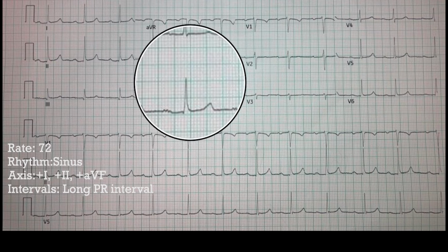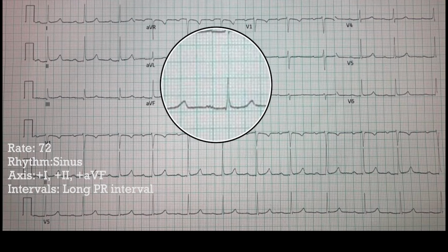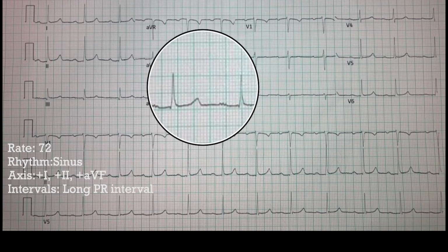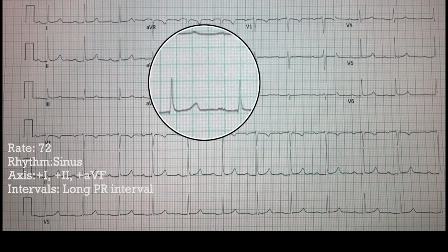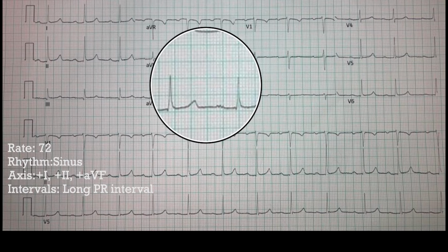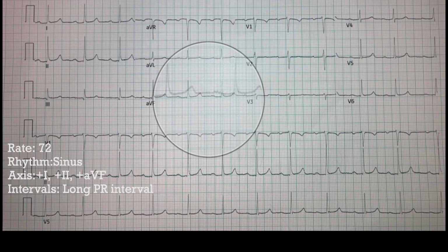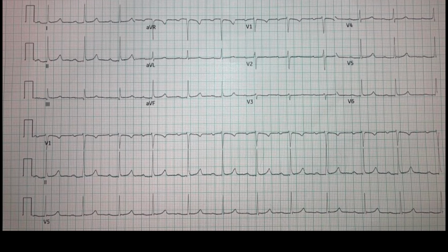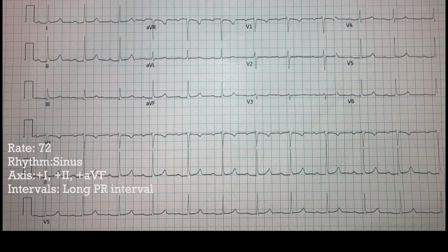In this case, there to there, does the T wave finish up? Is it back to normal before about halfway through those two things? And it looks like it is. So we'll call this, estimatingly, we don't see a long QT interval. We don't see a prolonged QT interval. So in this case, we just see a long PR interval, and that's it. Along with that, we got rate, rhythm, axis, a long PR interval.